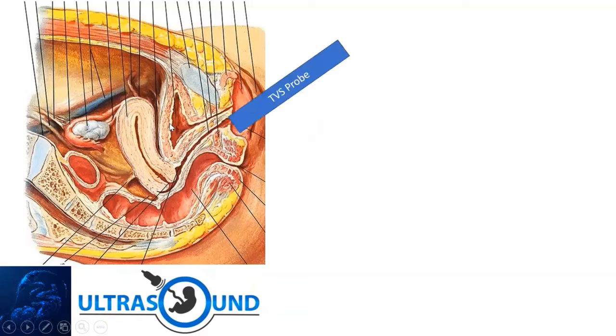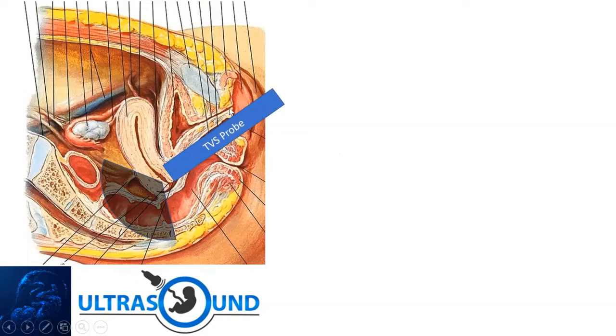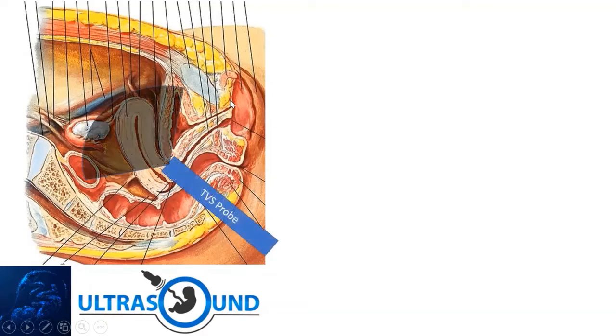Most of the time, you will be in a standing position, so your probe has to go down because the vagina is pointing posterior. When you point posteriorly, when you go in, you can only see the rectum. When you have an anteverted uterus, you need to push your probe downwards to the floor so that you can actually see the fundus of the uterus.